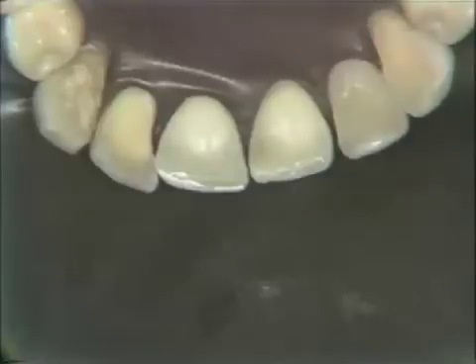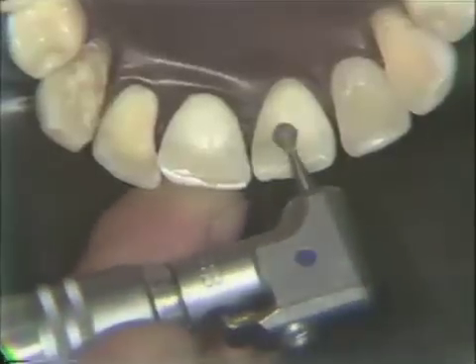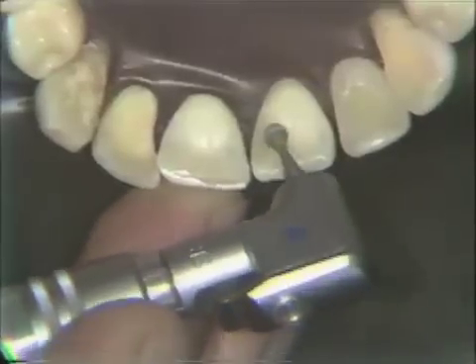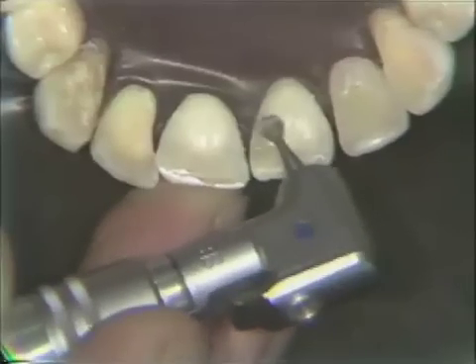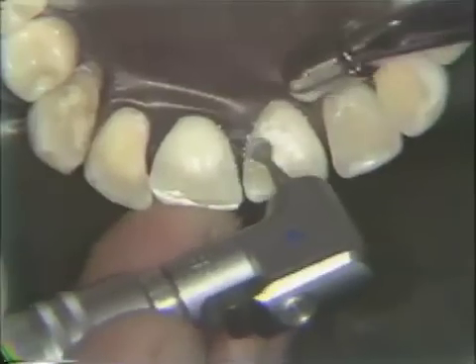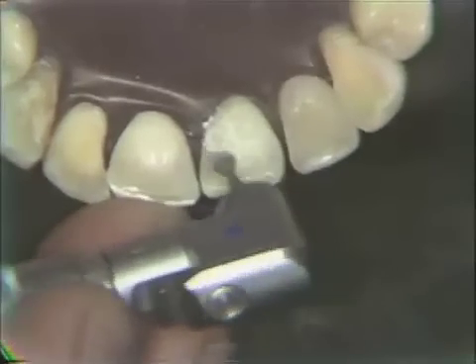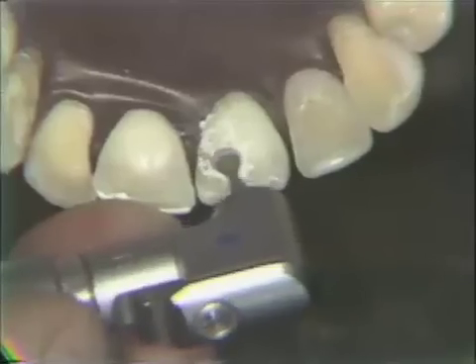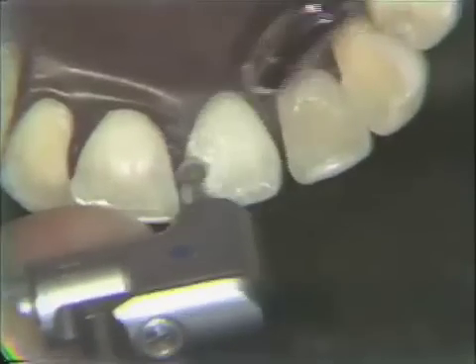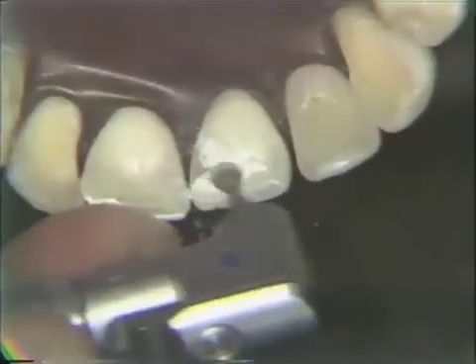In this case, we're going to start using the round green stone on the lingual portion because we did have a bit of excess, which most of us will have as we fill these. This again is a light touch, relatively high speed, but very light. We want to reduce the friction and the heat generated as much as possible.